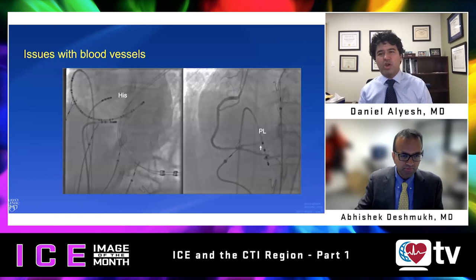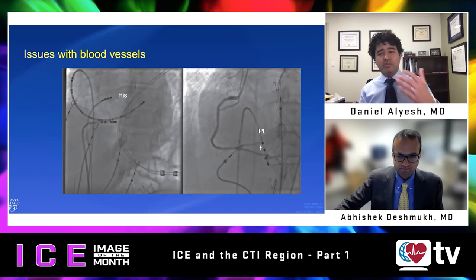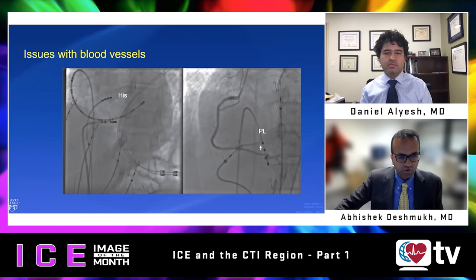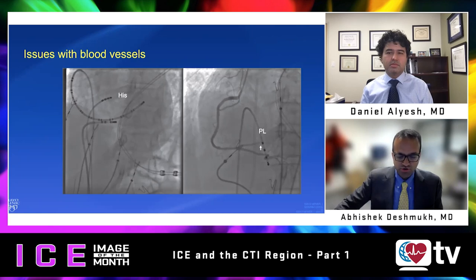I want to take us in a direction that I think is an area of significant concern: the right coronary artery and ablation of the CTI region. On the left image, this is an LAO view — you can see the His on the septum and a multi-electrode catheter spanning the right atrium going into the coronary sinus. The standard teaching is we get more contact on the tricuspid annulus by bending the catheter down and clocking, but sometimes if we clock too aggressively you can end up in the middle cardiac vein.